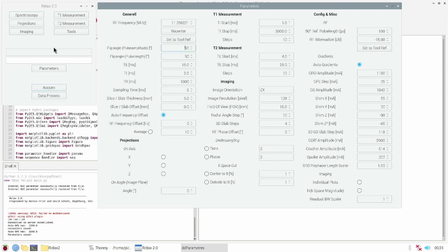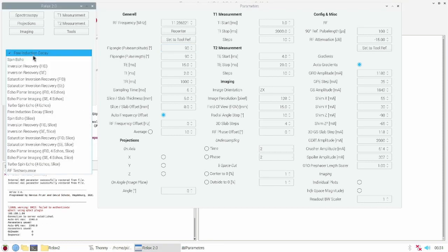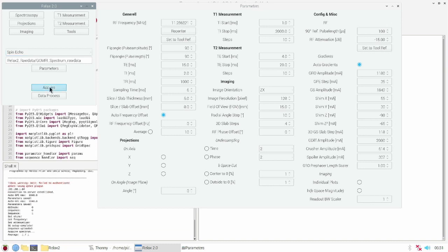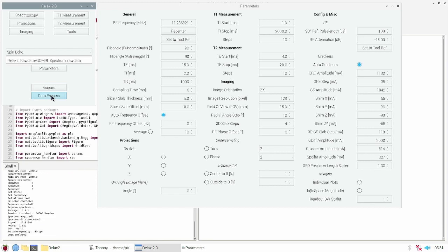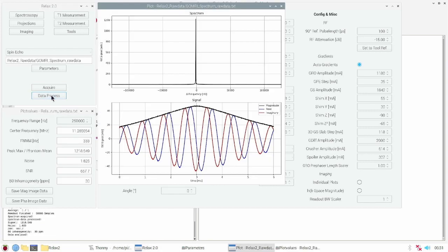To acquire my first spectrum I click on spectroscopy and choose the spin echo sequence. Then I can press acquire. The MR acquires the data which I now can process. Here you can see the spectrum data.